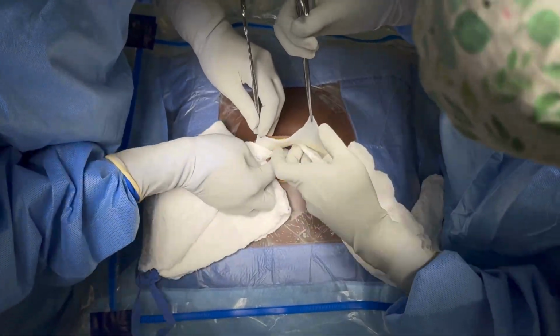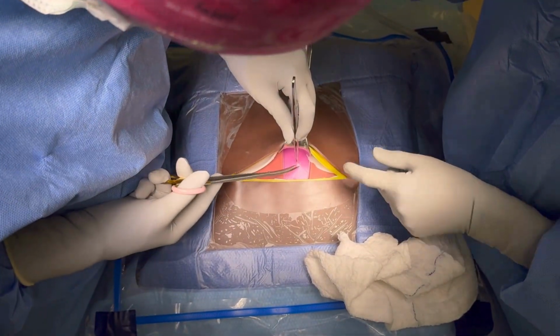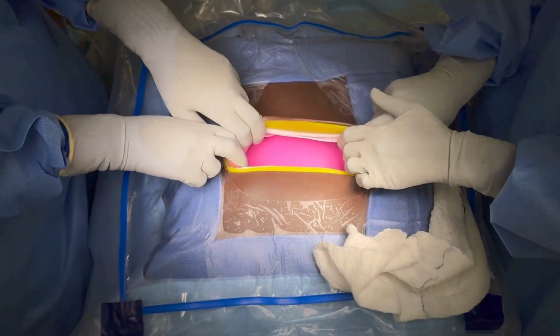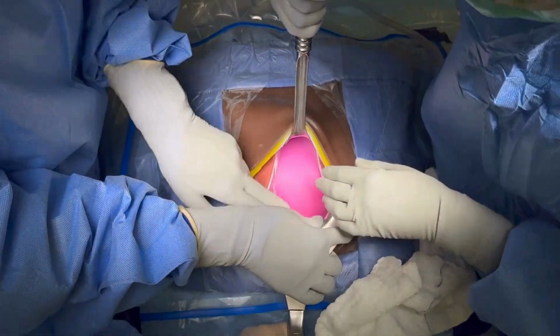The peritoneal layer is then grasped with pickups, and a small incision is made using Metzenbaum scissors, which is then extended bluntly with the aid of the assistant. A bladder blade and Richardson retractor are then inserted to facilitate visualization of the uterus.